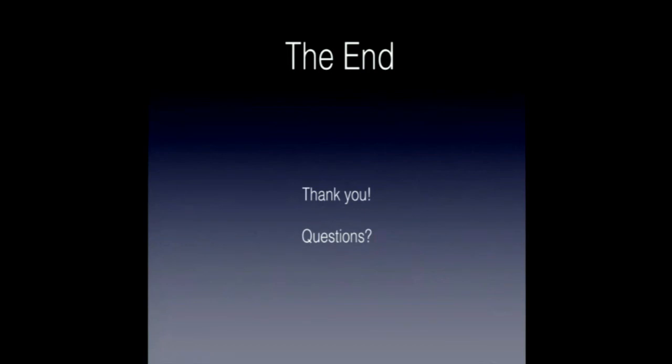I would say this inspired me to hone my skills again. It's much more doable than you think. And there's that Toronto website for transthoracic echo or the FOCUS, and we should have it on our lab computer. And when you have a delay, just go grab our great CX50 machine. Just do a parasternal view. Try and get the aortic valve. Try and get an apical. Try and line up your beam. And it's just sort of the mechanics first, and then you can start to apply the information.